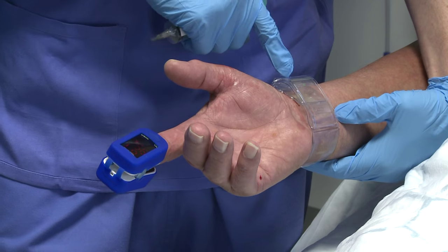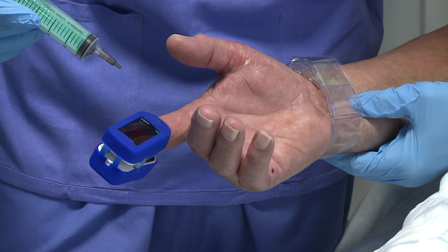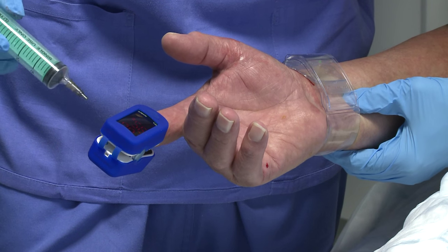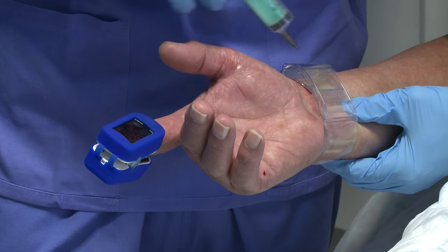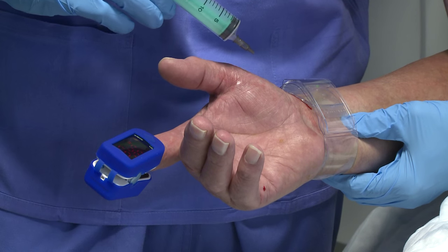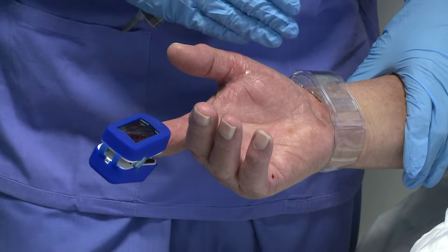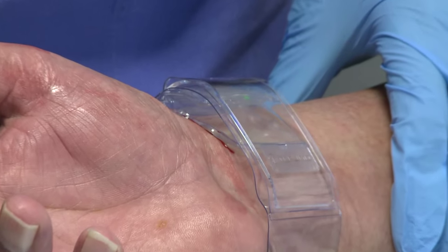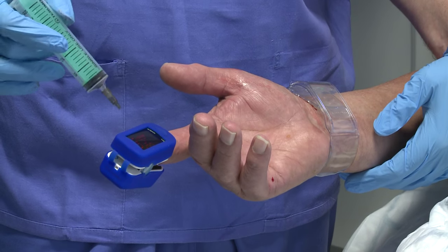When we occlude the ulna we assume that in also occluding the radial we'll lose this waveform. So now pressing quite firmly on the ulna — it would appear at this stage that we still have a waveform. We have to presume that in occluding the ulna artery we have actually maintained patency of the radial artery in order to gain a saturation in the finger. We can't inflate this balloon any higher, but I'm very confident we have no evidence of bleeding at the skin site, and with the ulna occluded we still have patency evidenced by the saturation at the fingertip.